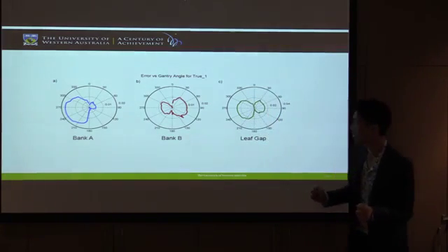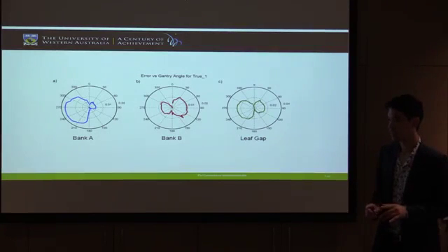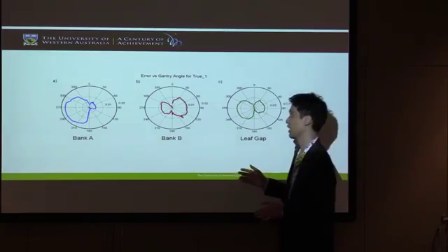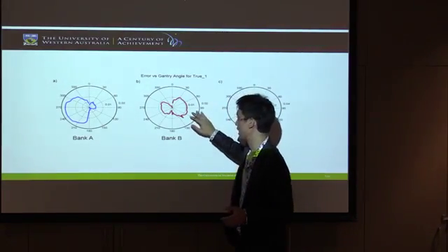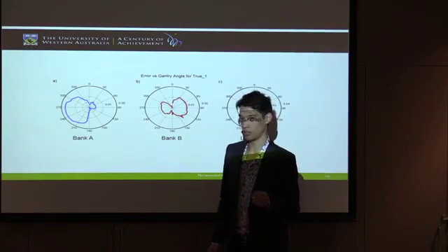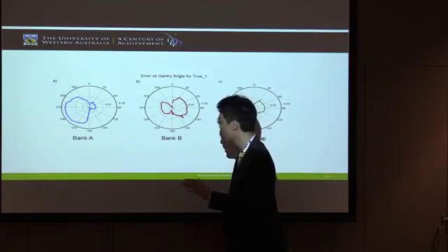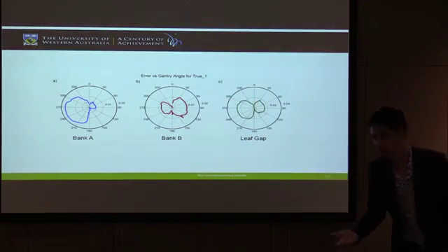I should say, even though this is incredibly weird, the scales that we're actually looking at, on TrueBeam machines for picket fence, the error is 0.01 millimeters. So that's like, what, 10 microns? So it's not clinically relevant at all.